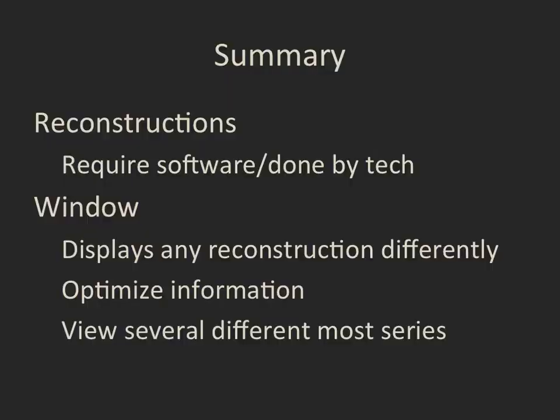So just to summarize, reconstructions are different from windows. Reconstructions require software, and they are typically, but not necessarily, done by the technologist on the raw data. The window will allow you to display any type of reconstruction differently, enabled to optimize information, and we virtually always have to view each CT reconstruction on several different windows to be able to maximize the diagnostic information that we can obtain from it.